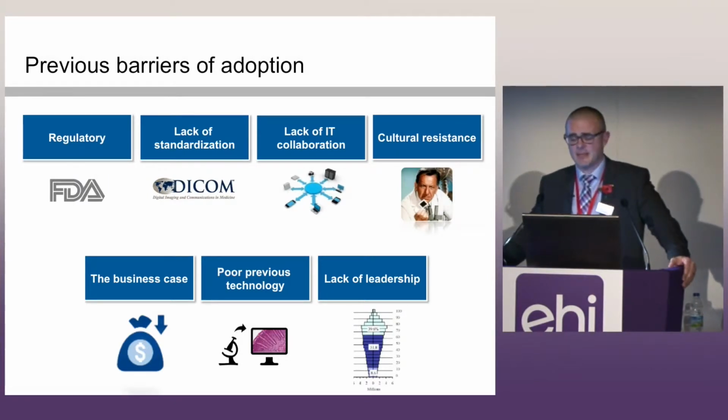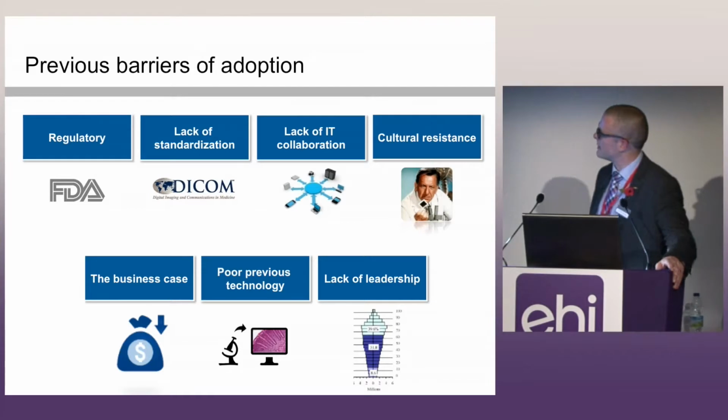There's been a lack of standardization. The DICOM standard has not really been implemented widely across digital pathology right now. Slide scanner vendors still produce image formats in proprietary formats. When looking and reviewing your solutions, make sure that you consider a vendor that is able to accommodate these proprietary formats until such time that the DICOM standard is widely adopted.